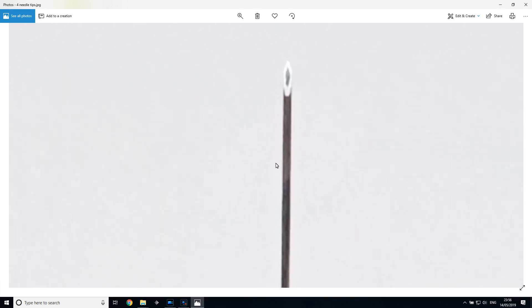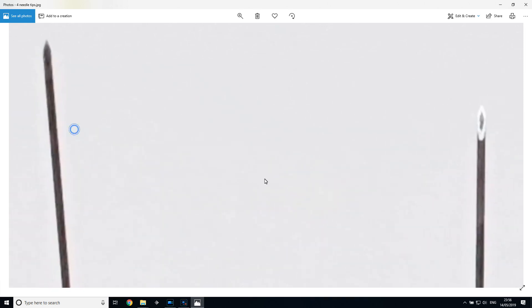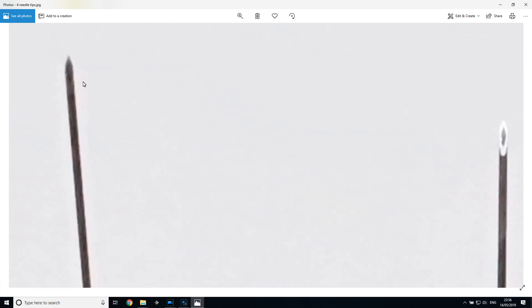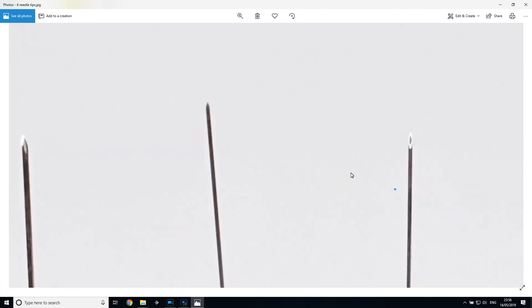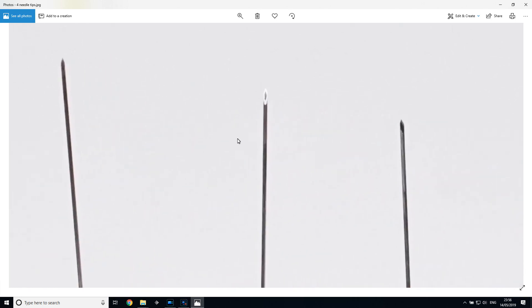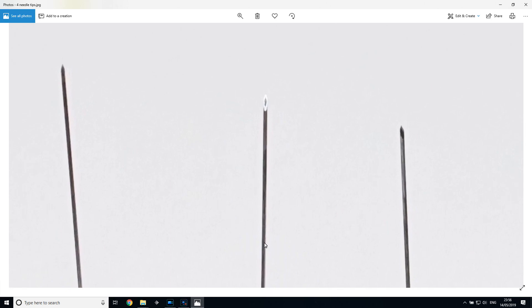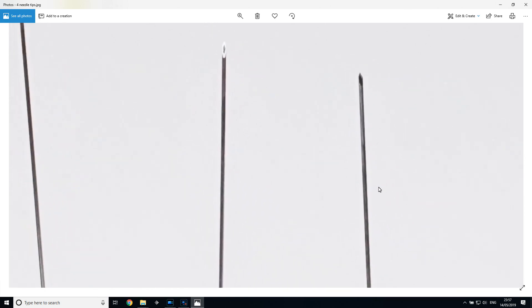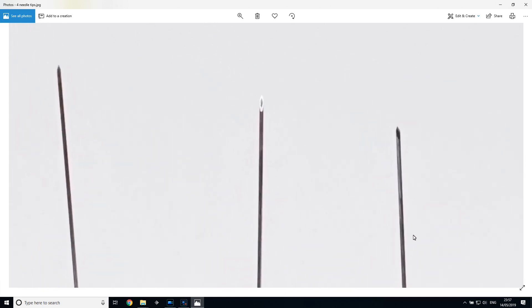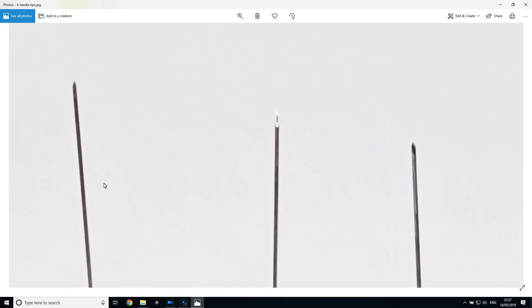Interestingly, the Technomed one has actually got a very similar configuration to the Tecca one. And when it came to inserting these three different needles, the Ambu one was the easiest to insert, followed by the Tecca one, and then the Technomed.